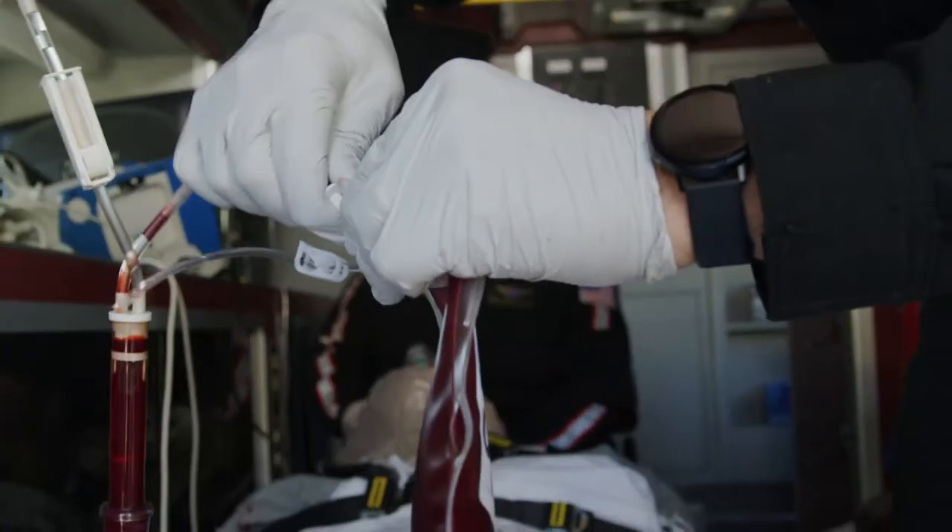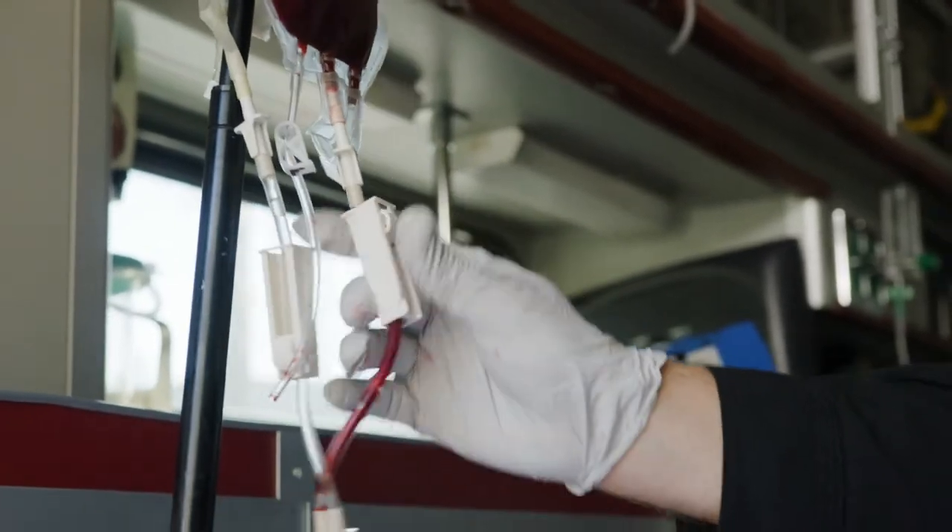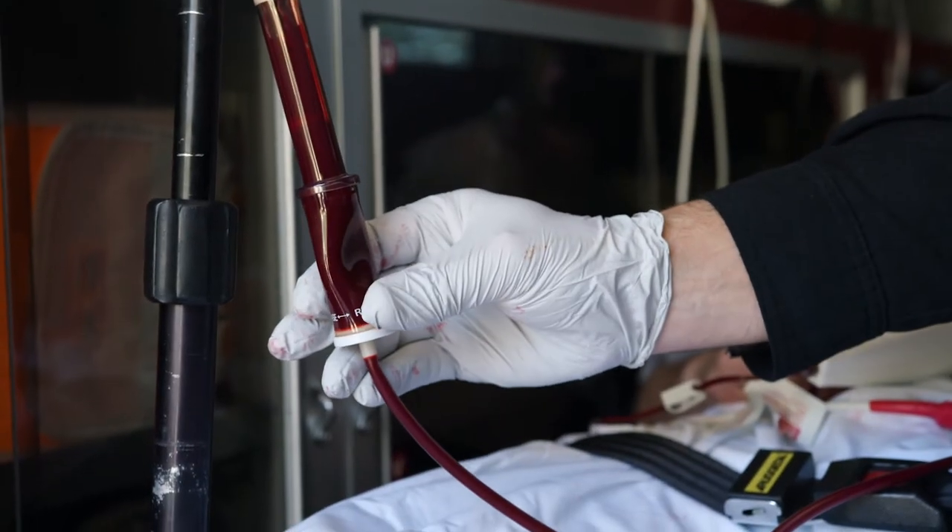Close the clamp. If an additional bag is needed, connect the next unit and open the clamp. Squeeze the air check to reprime and continue infusing.